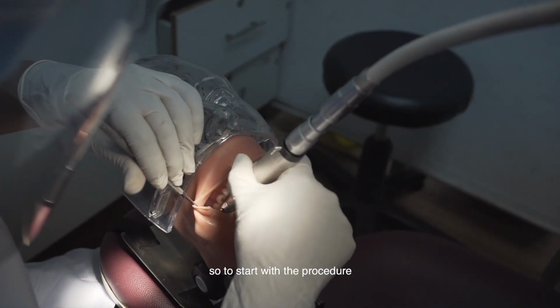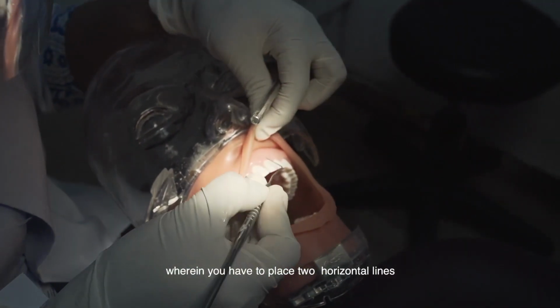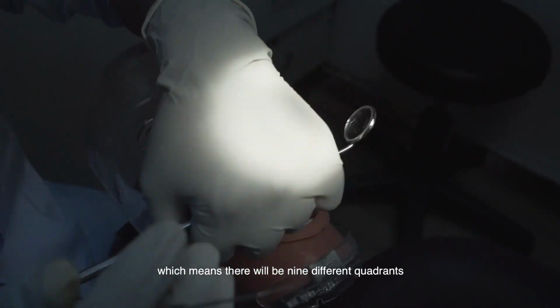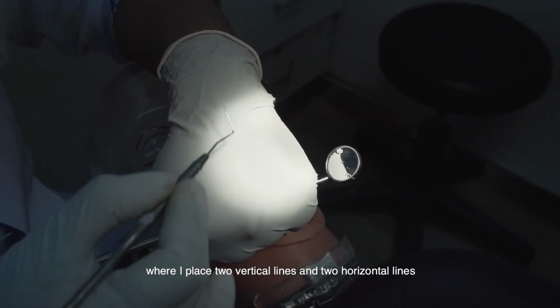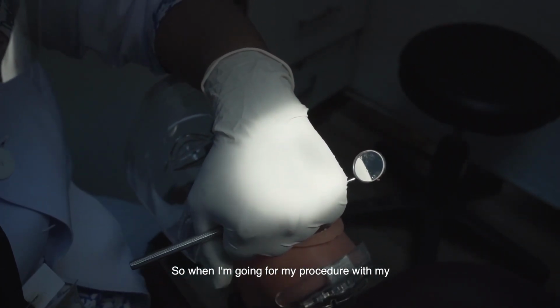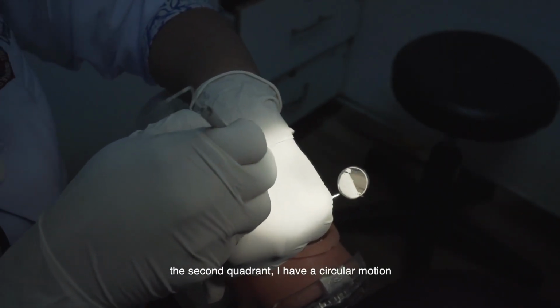To start with the procedure, I will explain the procedure first on a flat surface, wherein you have to place 2 vertical lines and 2 horizontal lines, which means there will be 9 different quadrants. To tell again, imagine this to be my tooth surface area, where I place 2 vertical lines and 2 horizontal lines. So I have 9 different quadrants here. When I am going for my procedure with my micromotor, I go with a circular motion. So the first quadrant I have a circular motion, the second quadrant I have a circular motion.